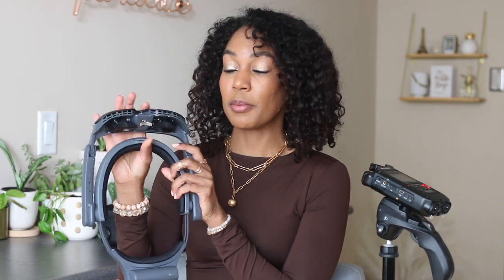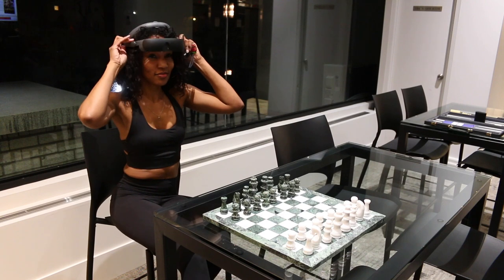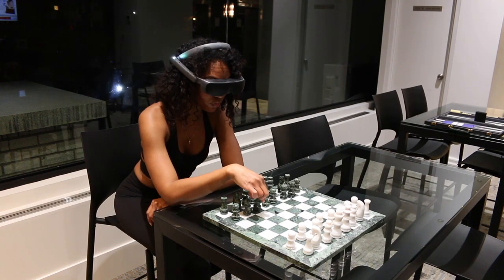As per usual I'm going to let you know the good, the bad, and the ugly — what I love and what I don't love so much about this device. Let's get into it. But first, let's talk specs. This device is sitting at 434 grams. I asked them — I want to be specific. That's pretty lightweight considering how much tech and time has been put into this device. When you add the battery pack it's about an extra 100 grams.